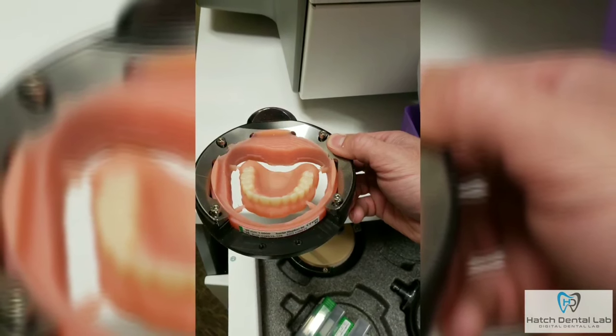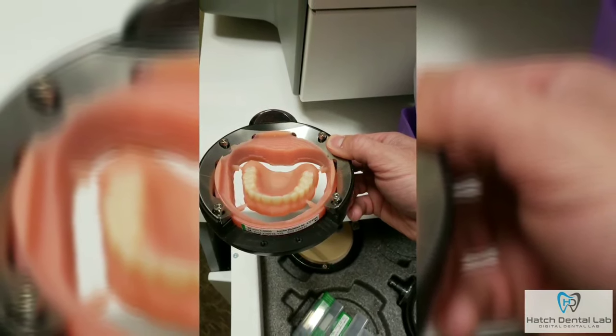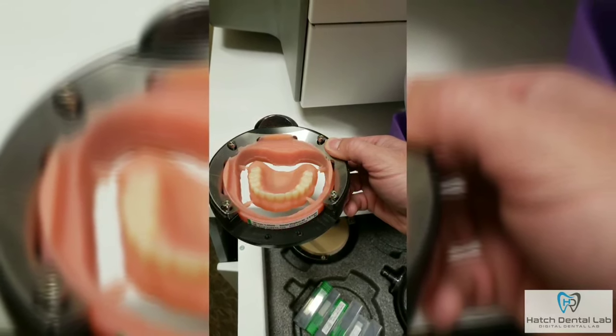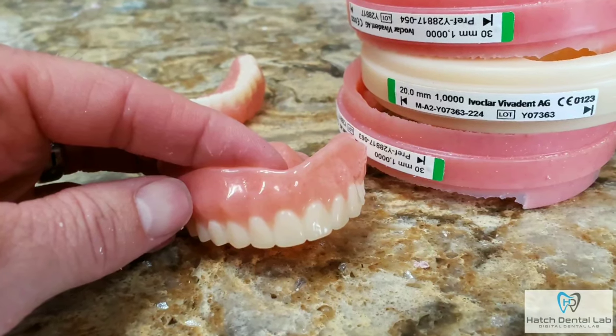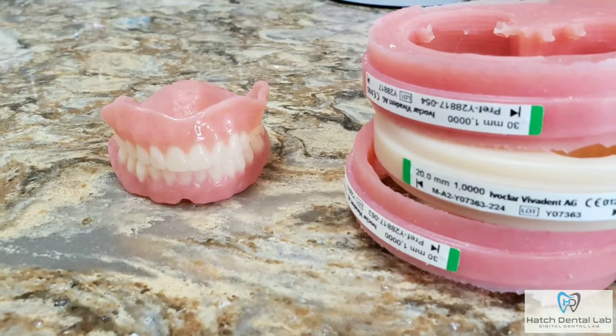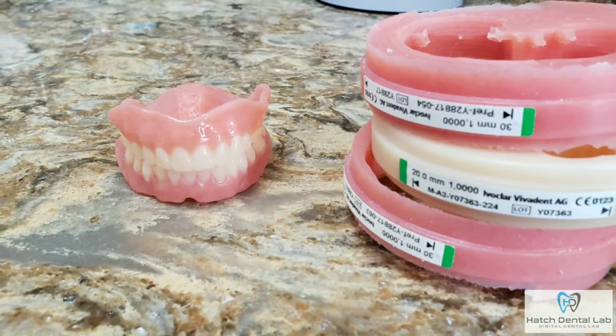The denture is almost finished up. All we need to do is pop off the four holding bars, do final finishing, and the denture is ready to go. You will see the difference the minute you deliver your first denture. When you wipe off the pressure indicator paste, it will slide right off, showing how easy it is for the patient to keep their denture clean.